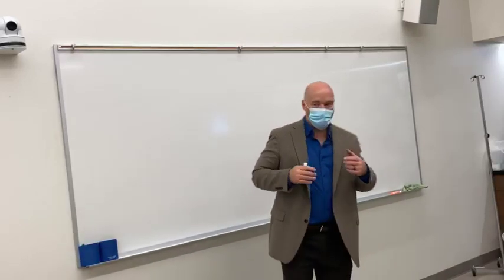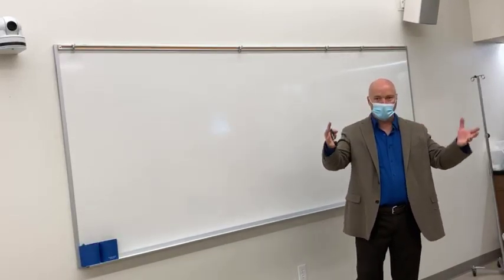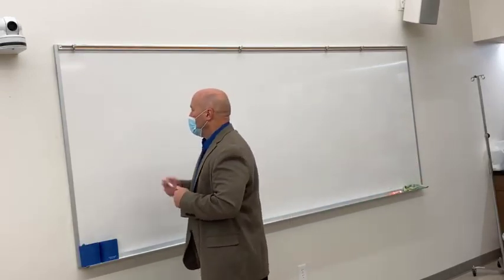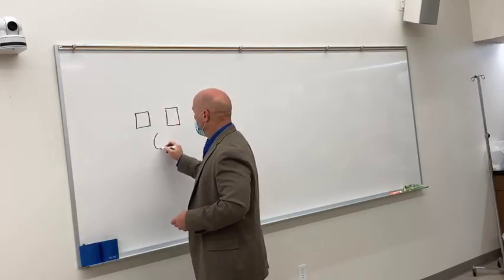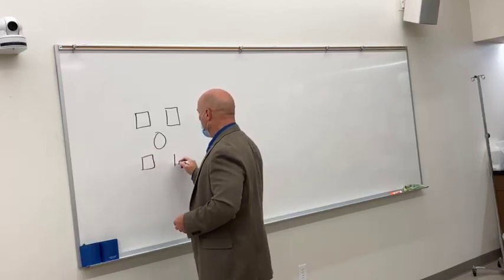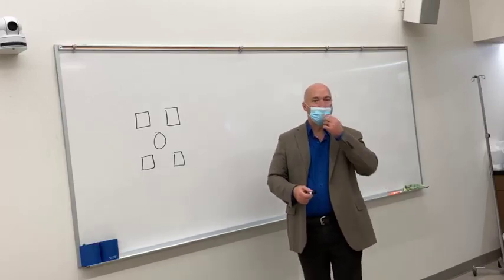Whenever you get to clinicals, what you need to do is take a look at your wall bucky. You can't see it on the table bucky, but you can see it on a wall bucky. What you'll see is either squares or circles like that, at least like that. Sometimes you'll see two more down here. And those are representative of your phototimers, okay?